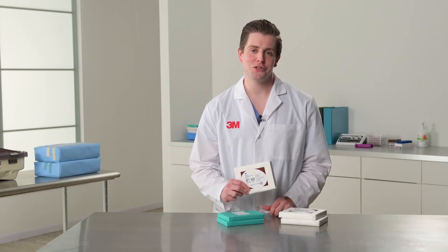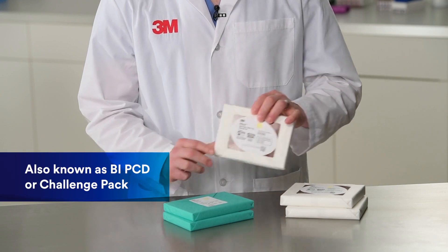This is a 3M biological indicator process challenge device, also known as a BI PCD or a challenge pack. 3M recommends that you run a BI PCD in every cycle. The BI PCD should be placed in the most challenging area of the sterilizer chamber. There are three rules for placement depending on the sterilizer and the cycle that's being used.